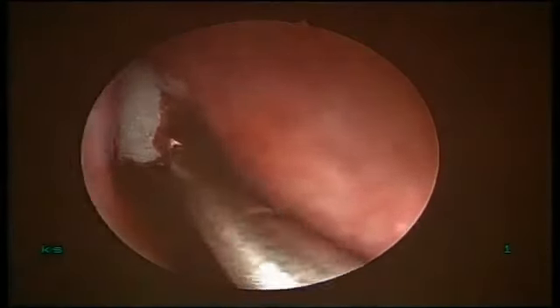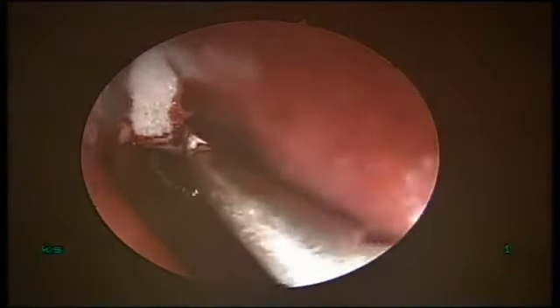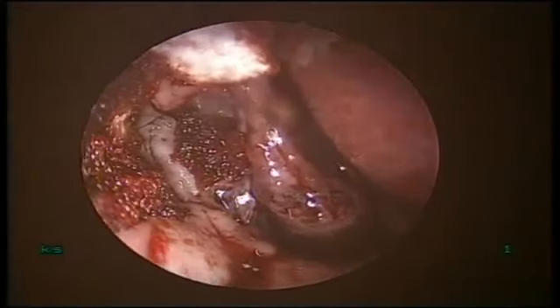See that upper part of the flap? This will remain stabilized with this. See nicely, the flap is there.